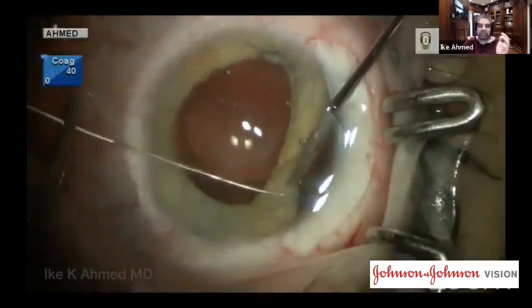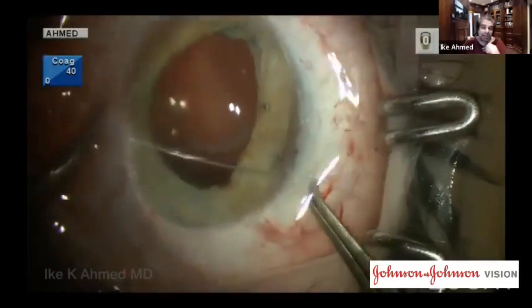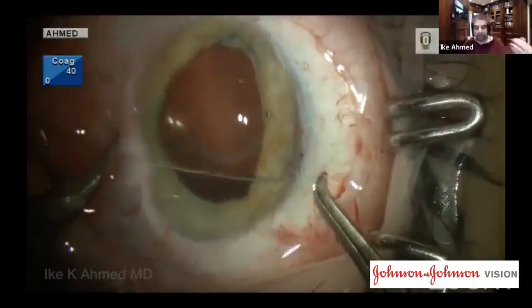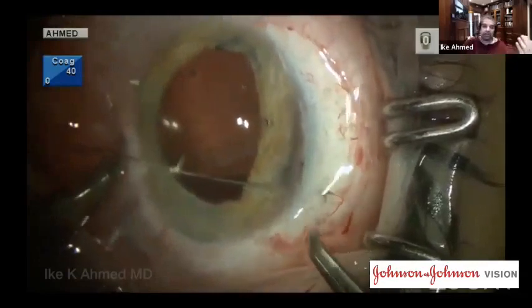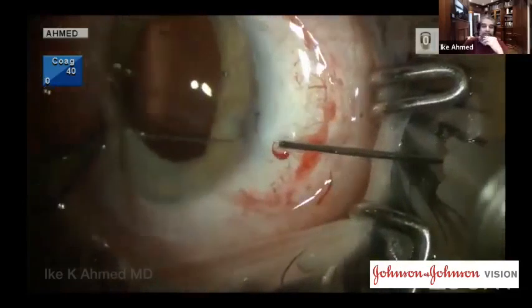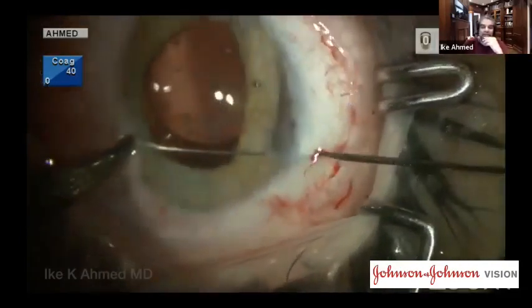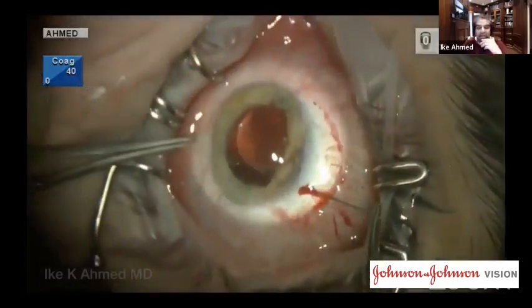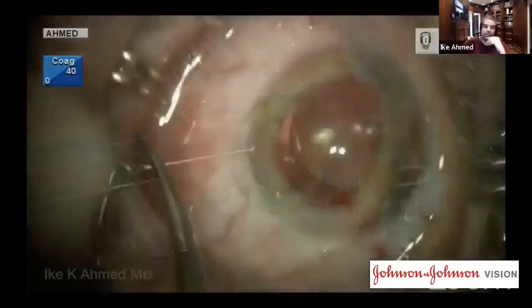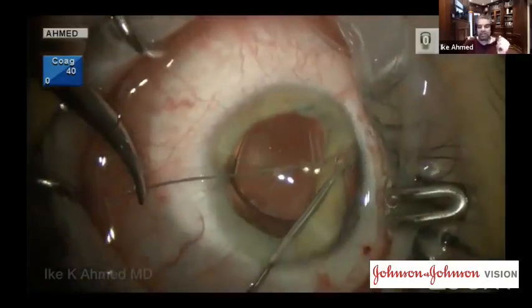In this case, I should mention the needle I'm using is a straight needle. I prefer a straight needle for dialysis repairs, going across the AC and through the sclera just behind the blue zone and the white zone, as you see here. I'm using a docking technique to dock the needle. This is an STC6 Ethicon needle, which docks nicely with a 27 gauge hypodermic needle. It's a double arm suture, again going through the same incision.